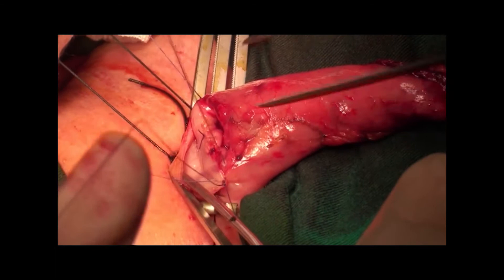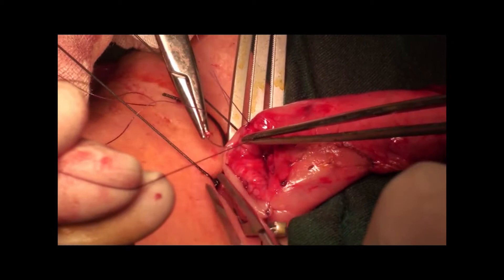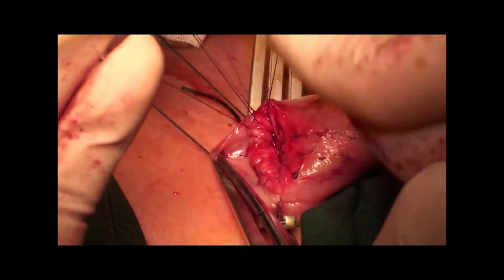Continuous sutures were used to create the mucosal anastomosis for the mucosal layers of the esophagus and stomach, towards triangulation of the tissue. Each stitch was placed approximately 3 mm deep and 3 mm apart evenly, without pulling the sutures to tie.